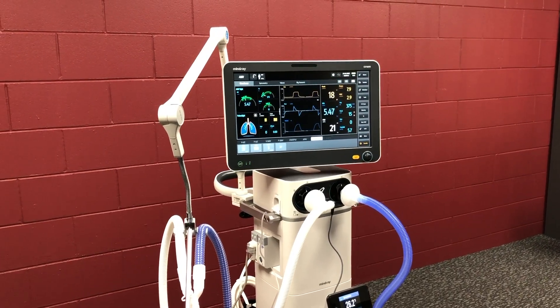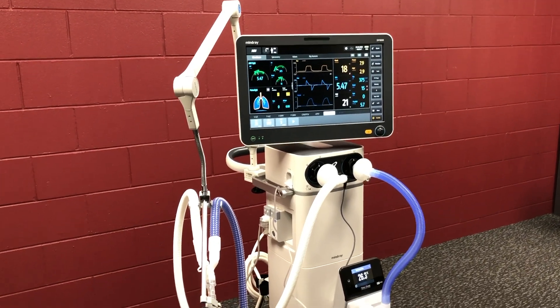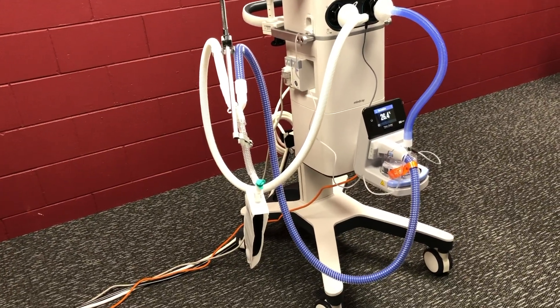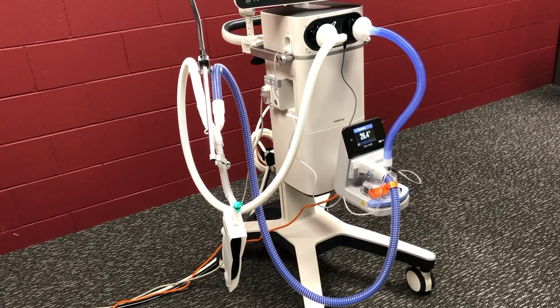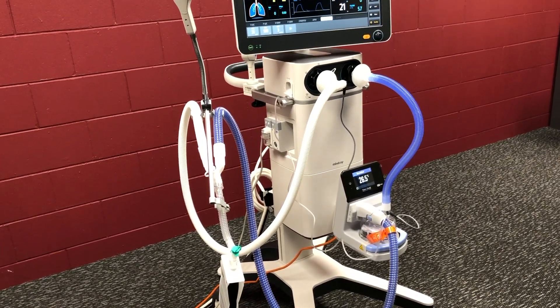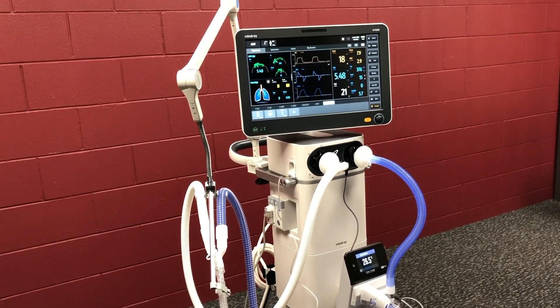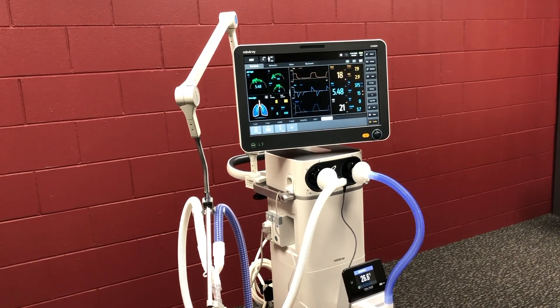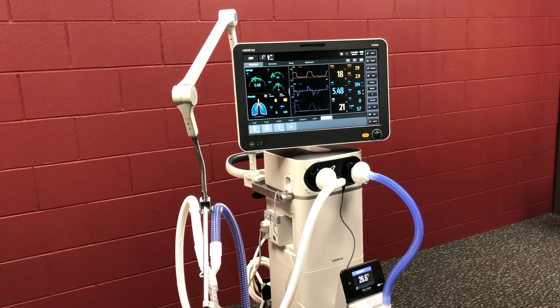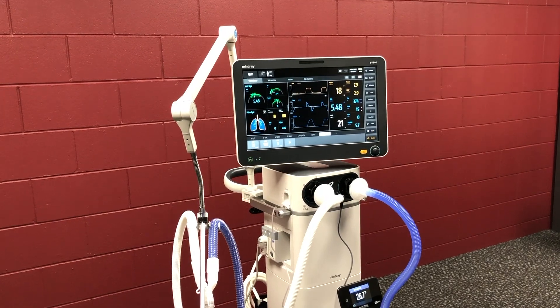So here's the Mindray SV800 ventilator and its main components. Down the bottom we've got four lockable wheels on a sturdy frame. We've got a Fisher & Paykel humidifier there today. The arm for the patient circuit — I'll give you a closer look at that soon. Handle at the back for manoeuvrability. We've got modules on the side, and the inspiratory and expiratory limb from the front, and the display at the top of course.